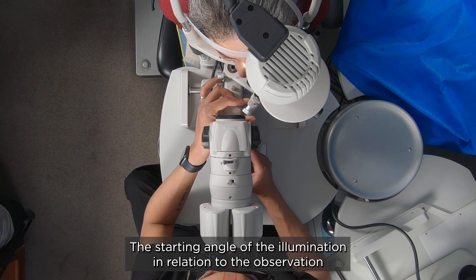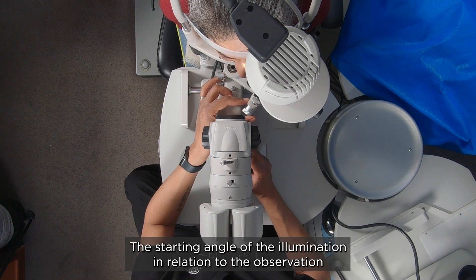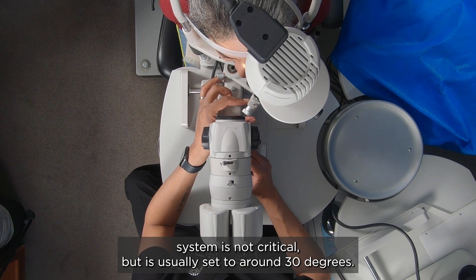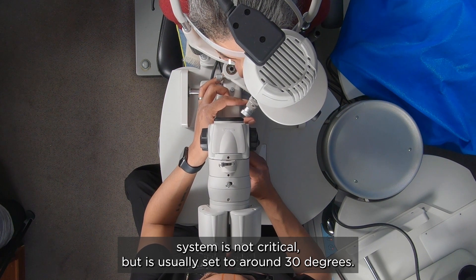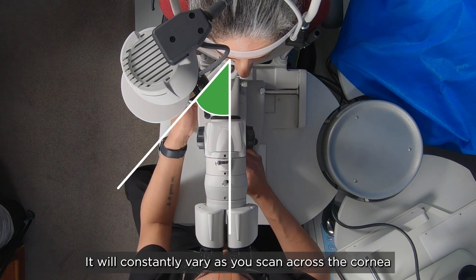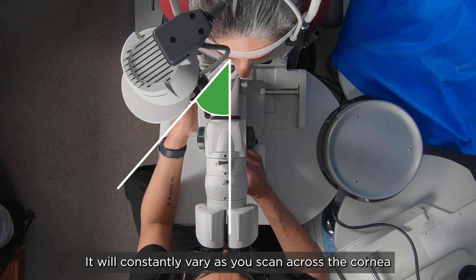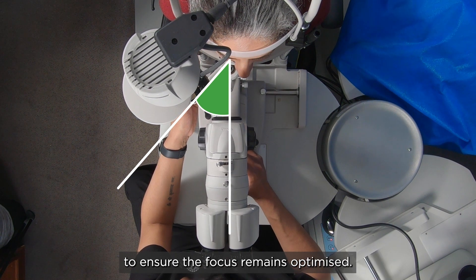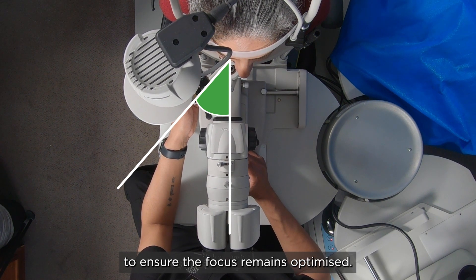The starting angle of the illumination in relation to the observation system is not critical but is usually set to around 30 degrees. It will constantly vary as you scan across the cornea to ensure the focus remains optimized.